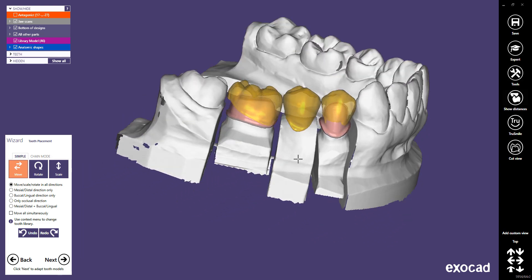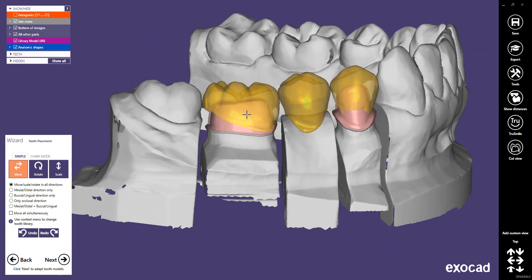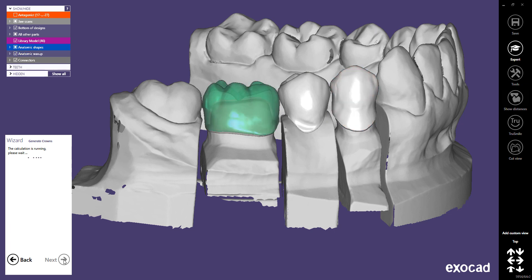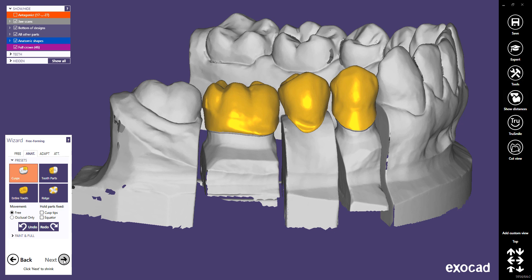You will find a more detailed explanation of this wizard step in a separate tutorial. Once you click the Next button, the copied teeth will be adapted to the margin as it would be done with real library teeth. The Freeforming window provides all known features — more details about the Freeforming step can be found in a separate tutorial.